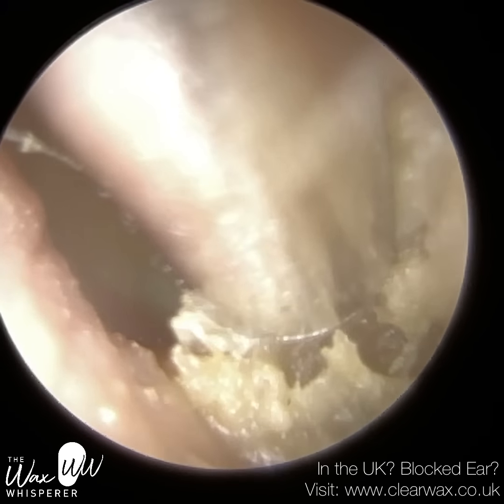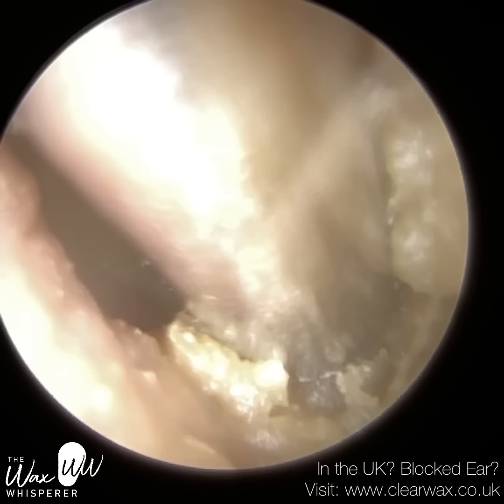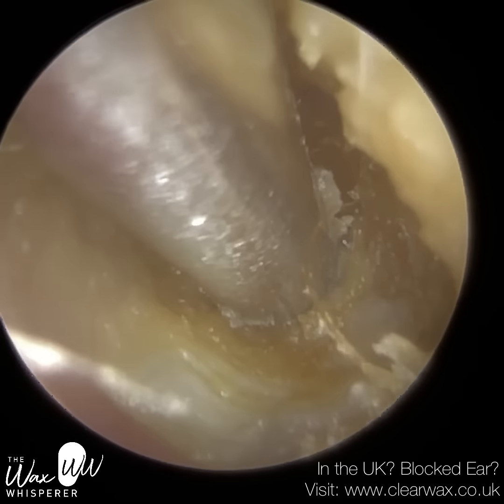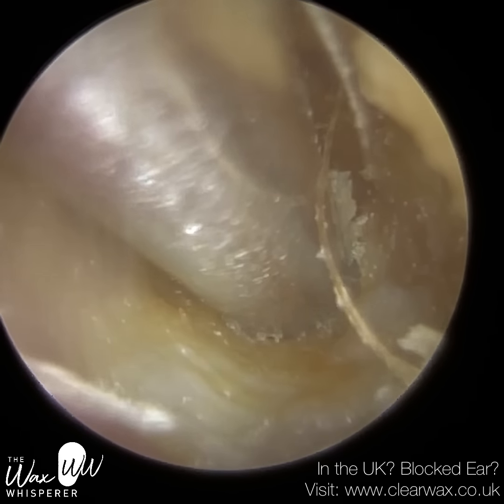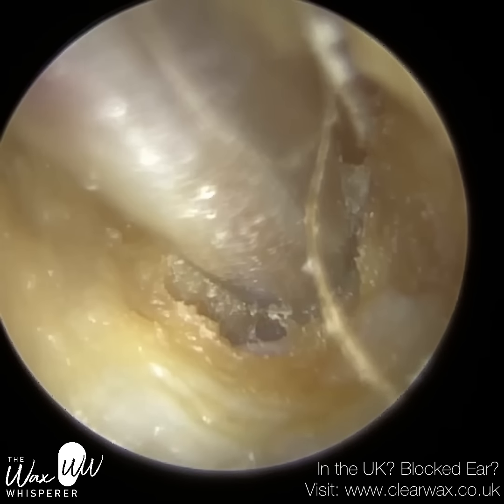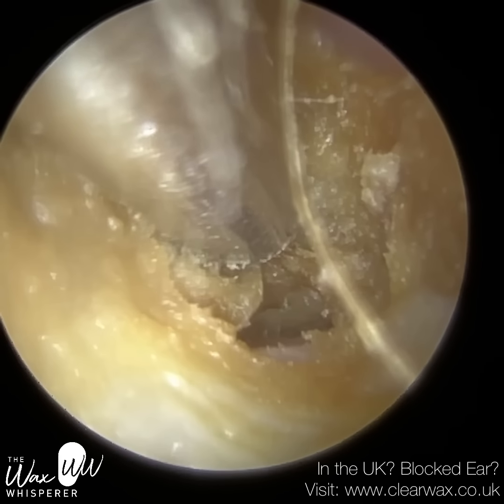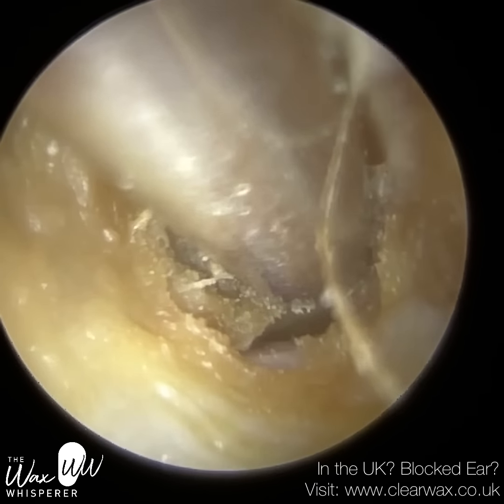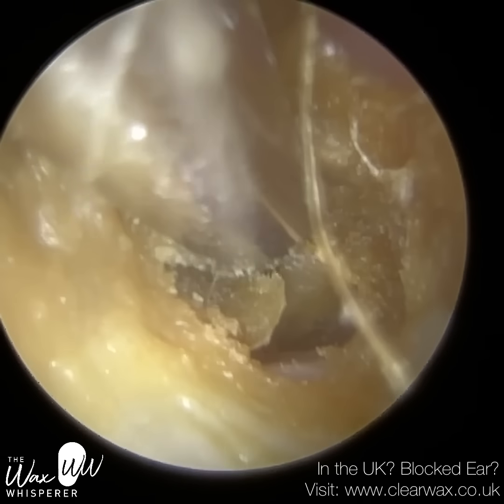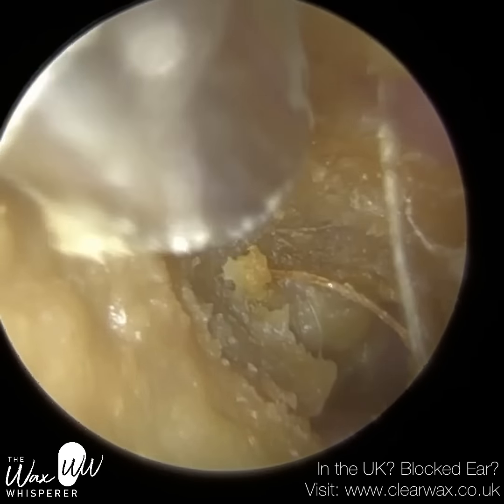And this dead mushy skin that I'm just vacuuming right now. What made this procedure more complex than your normal procedure is that the patient's ear canal is somewhat collapsed near the entrance. And having a collapsed ear canal is not uncommon in elderly patients. That's because the cartilage portion of the ear canal, the outer third, over time it can weaken with age. It can also weaken with trauma and chronic infections, and that causes the cartilage just to buckle under gravity.